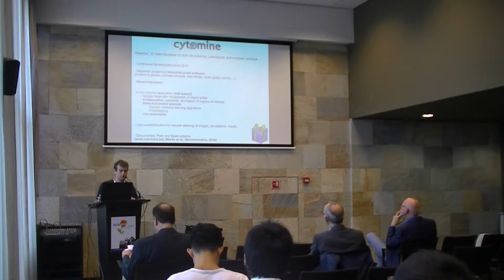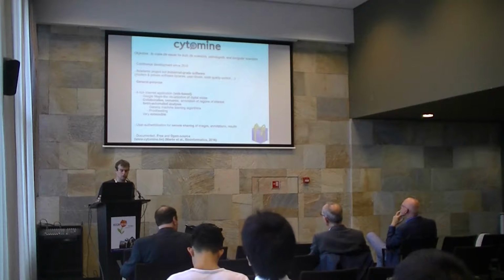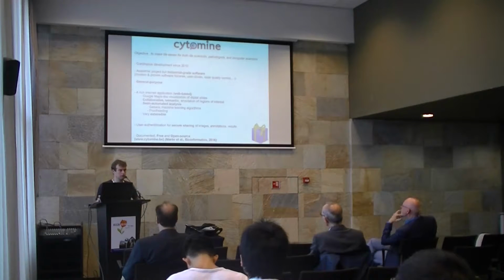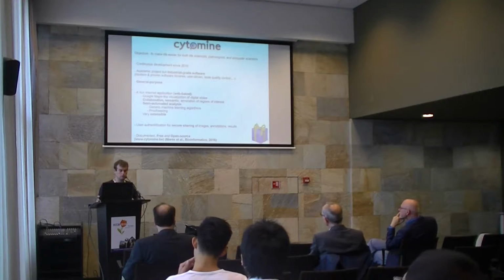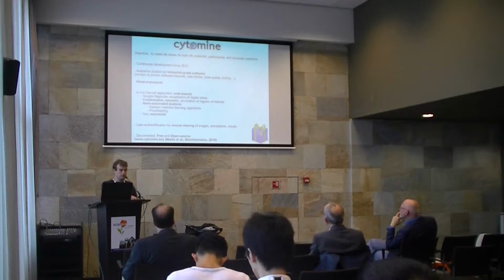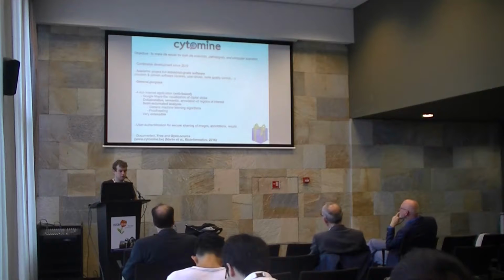This software has been developed continuously since 2010. It's an academic project with collaborators that are pathologists and biomedical researchers, but we followed quite proven standards in software development, so we believe our software now has reached quite good quality. It's a general purpose software. We started to work on it motivated by some application in lung cancer, but this is not specific to lung cancer, and I will show you several applications in different fields.